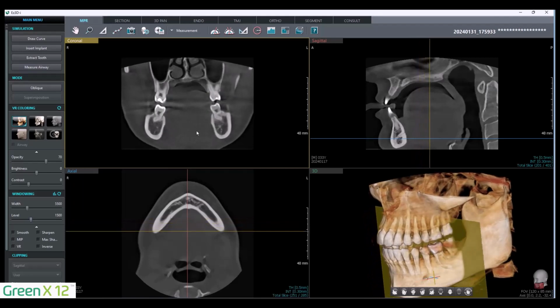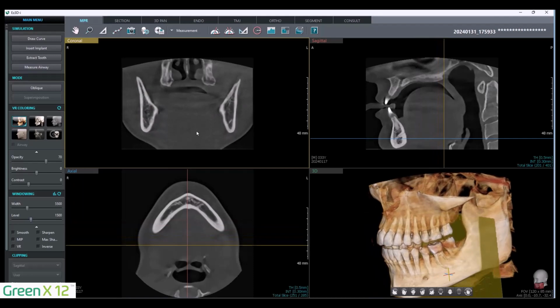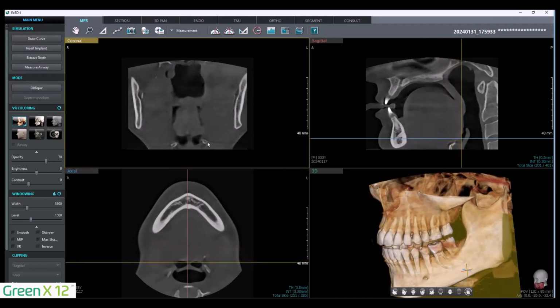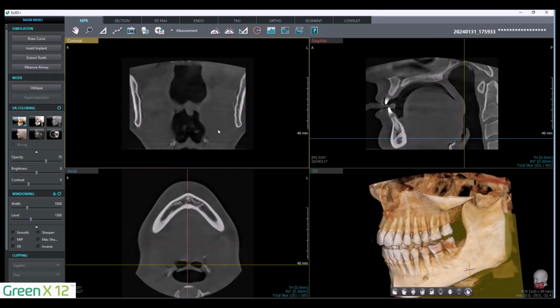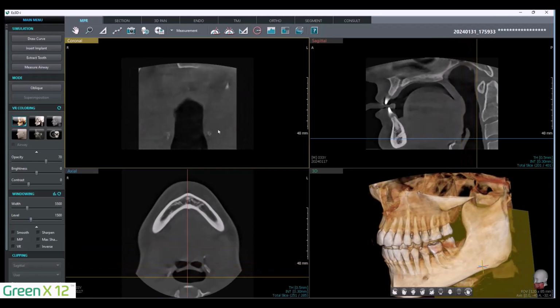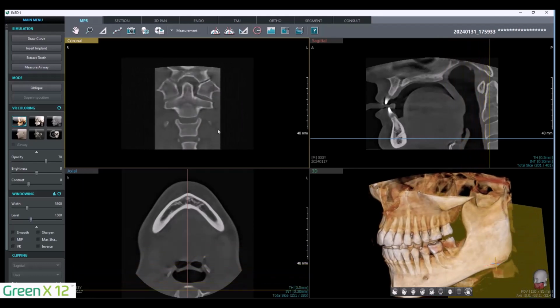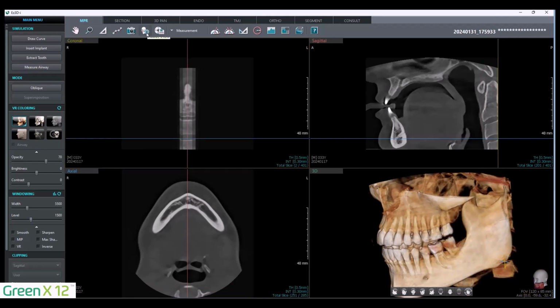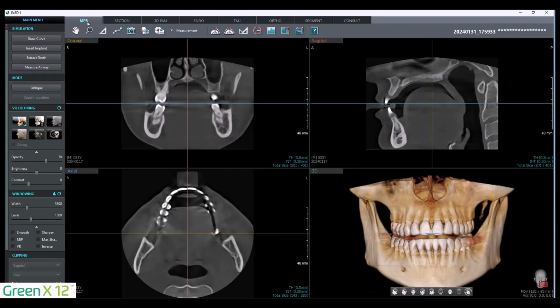and I'm following with my eye, going all the way posterior back through the entire scan. Hyoid bone here, and now we are back into our spine and at the posterior border of the scan. I'm now going to select the spacebar and reset my scan. That is our MPR window, brief overview.